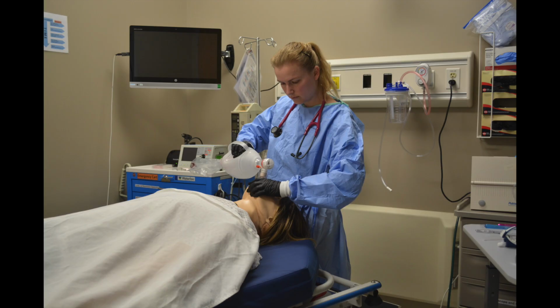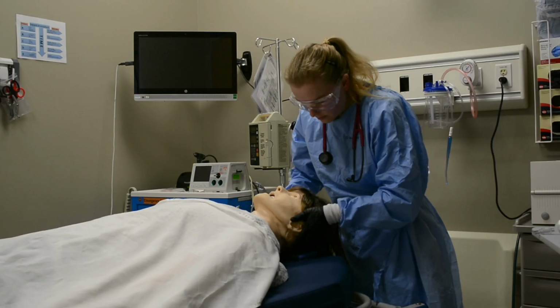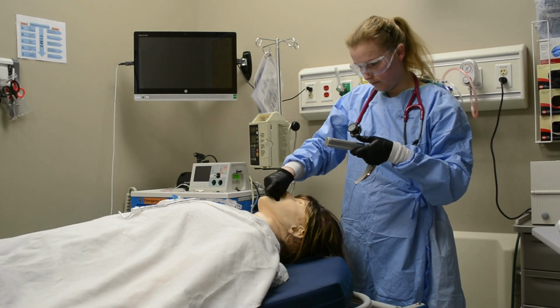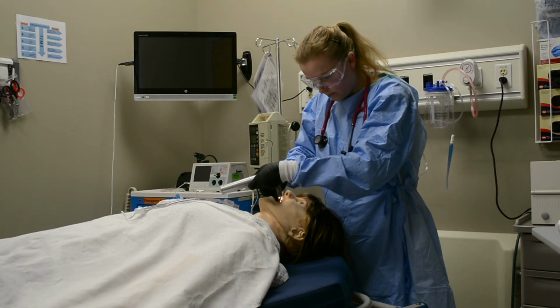Tips and tricks. Break to ventilate if you are struggling. Always remember the airway. Change something if you are unsuccessful. Change the patient's head position, the blade, or yourself. Do not be afraid to ask for help.